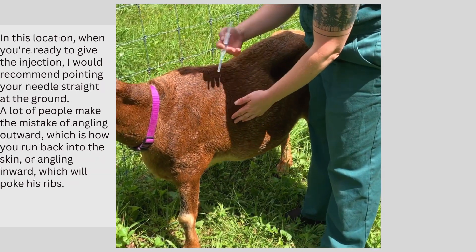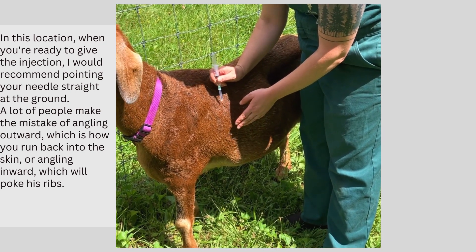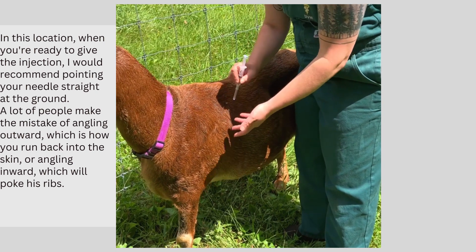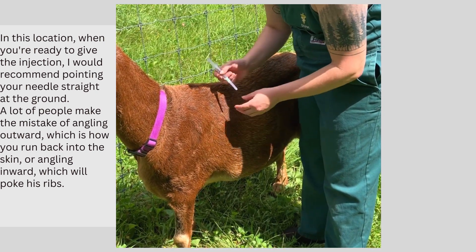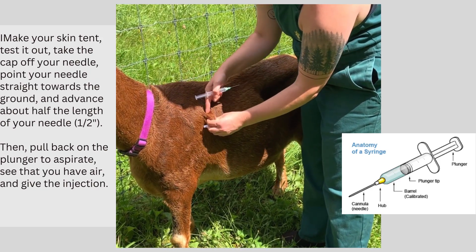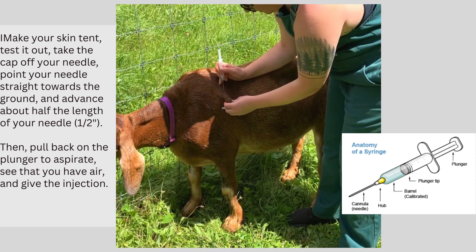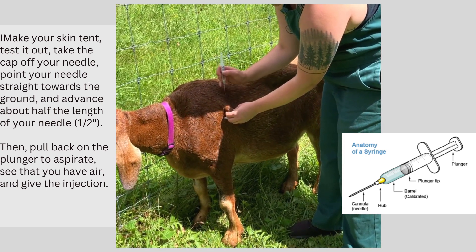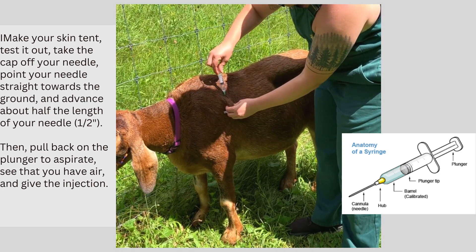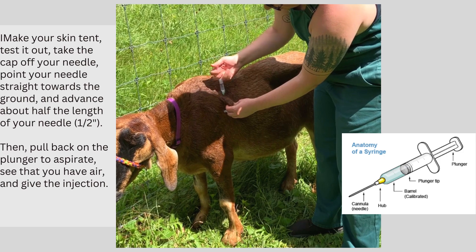In this location, I would recommend when you give that injection to point your needle straight at the ground. A lot of people make the mistake of angling outward, which is how you come back into the skin, or angling inward, which is just going to hurt. There's not a whole lot of muscle here. So once you have your spot, take your skin tent, test it out, take your cap off your needle, and point your needle straight towards the ground about half the length of your needle — whether that's a one and a half inch or a one inch needle, advance it only about half the length into that pocket. Then pull back on your plunger, aspirate, see that you have air, which means that you are in an empty space, and then go ahead and give your medication.